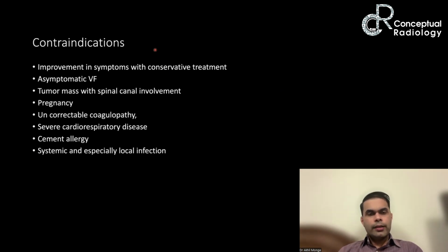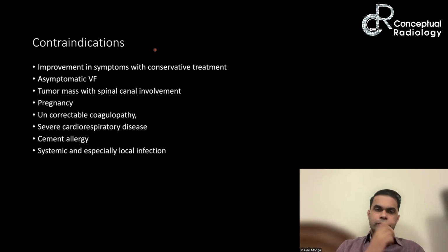So the non-healing signs can be because of the edema and the cleft. And you can see in the in-phase and opposed phase images that the opposed phase will have a drop of 20 to 30% in case of an osteoporotic fracture. So these are the things you need to remember.